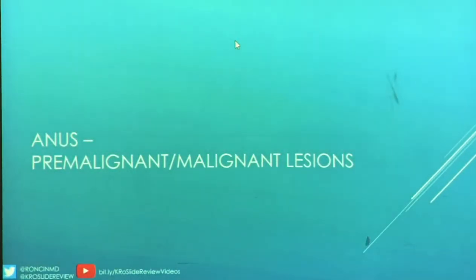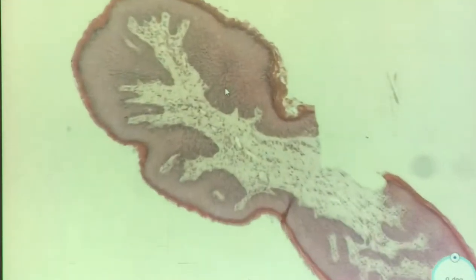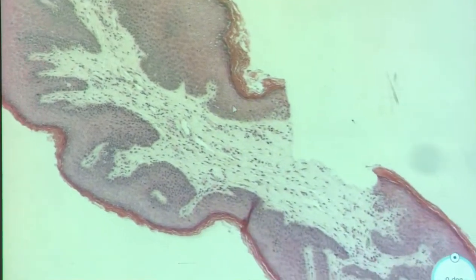Okay. We have 2 more lesions, so we are going to blast through these very quickly. I believe in you guys. Number 9. Biopsy. Woo! Okay. We're back in DermPath. Skin.